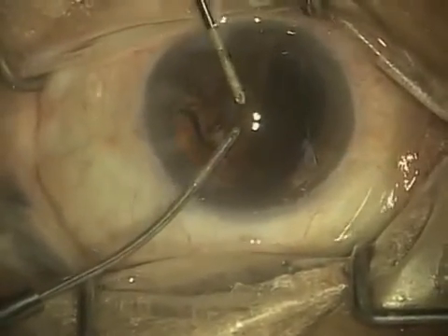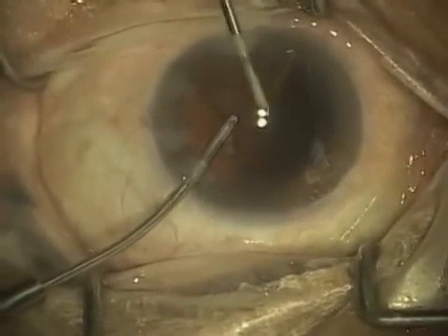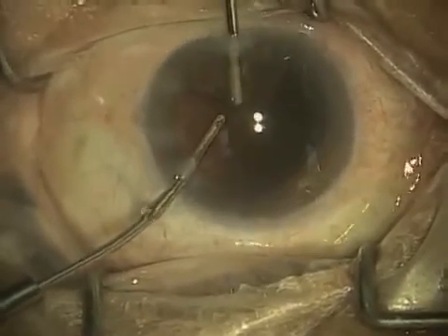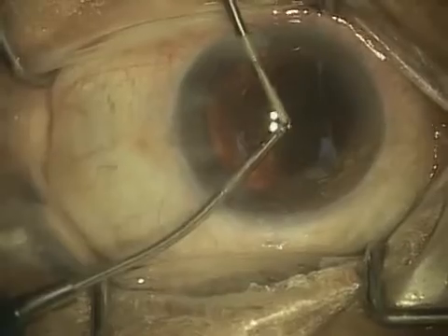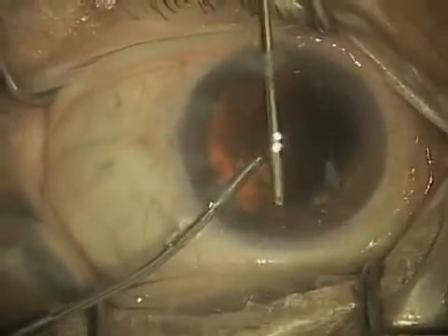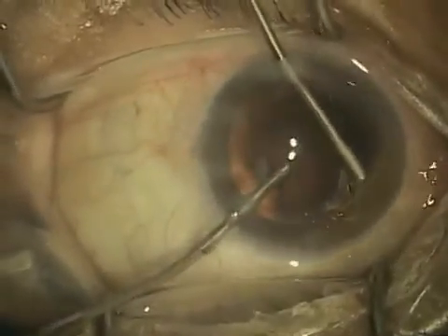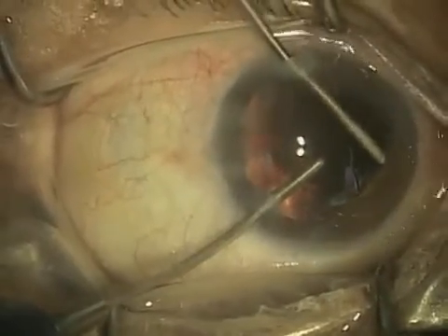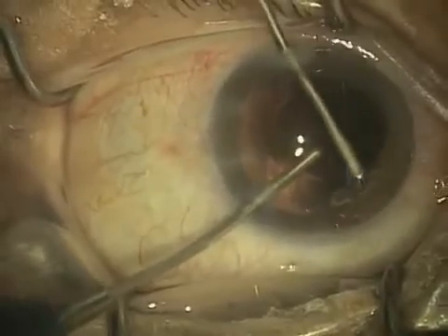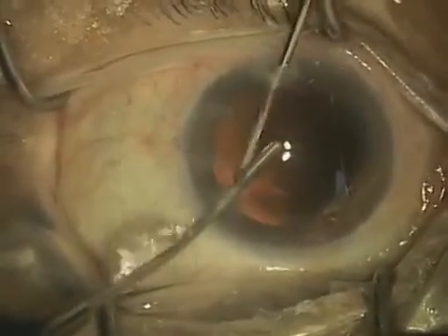The tip actually has a kind of rough edge that allows me to polish the capsule itself. Not everybody will polish the capsule because it is very, very thin and delicate, so it's a little stressful on the surgeon's heart to polish it. But here you can see I'm polishing it, as I do believe that polishing the capsule results in a more controlled healing response as that capsule shrink-wraps around the lens and eventually holds the lens in position.